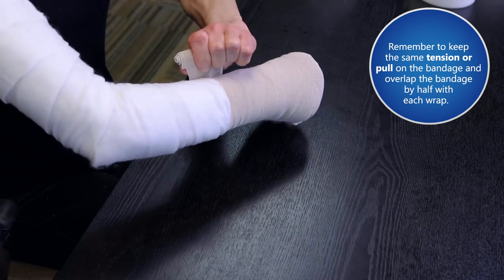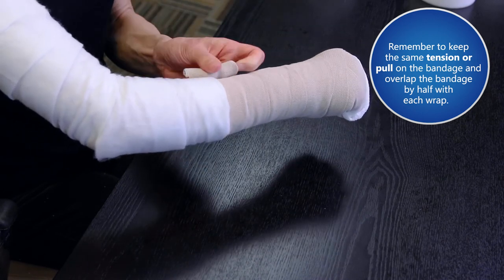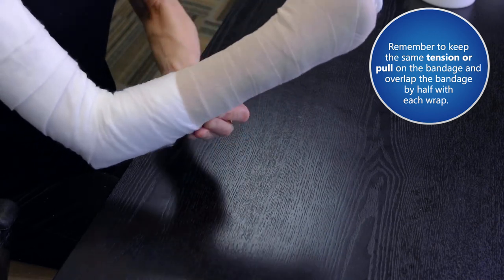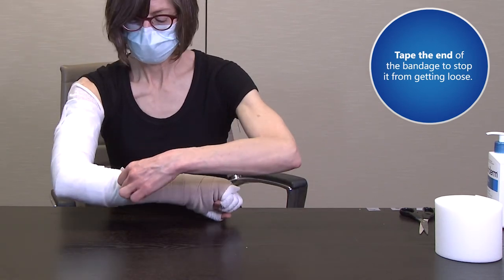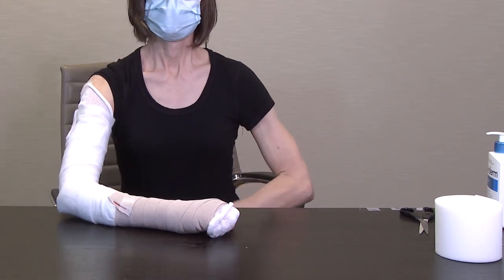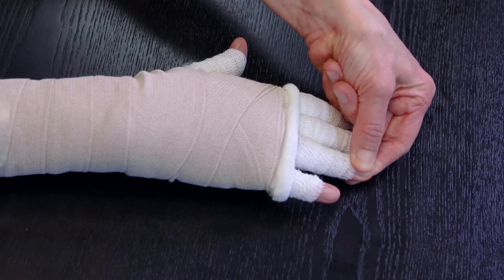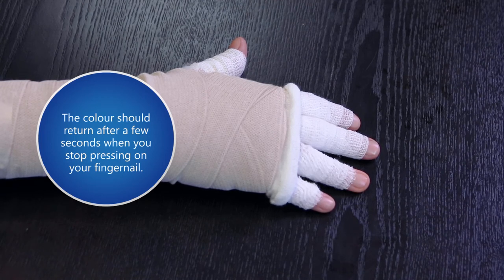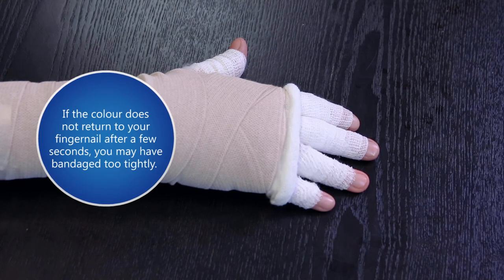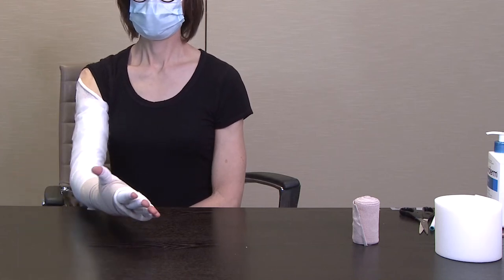Remember to keep the same tension or pull on the bandage and overlap the bandage by half with each wrap. Tape the end of the bandage to stop it from getting loose. Check your blood flow by doing the following test: press on one of your fingernails — your fingernail should lose some color or turn pale, and the color should return after a few seconds when you stop pressing. This means you have good circulation. If the color does not return after a few seconds, you may have bandaged too tightly and will need to remove the bandage and wrap more loosely. You can now see that you have more layers of bandage on your hand than on your lower arm.